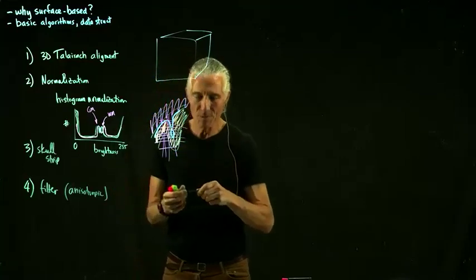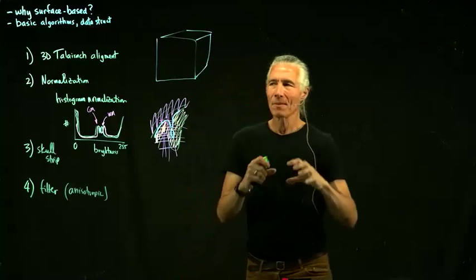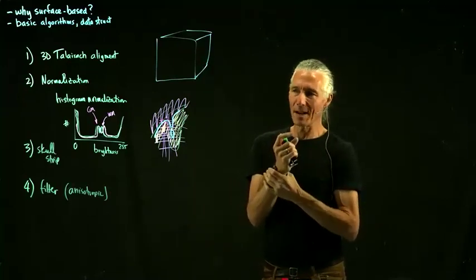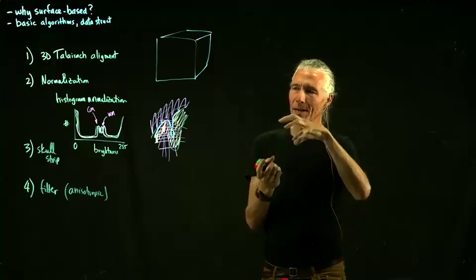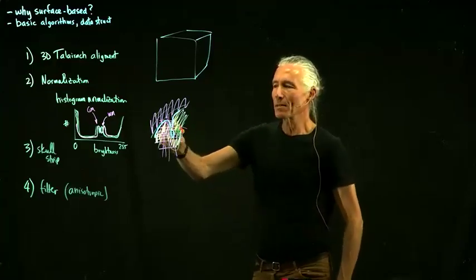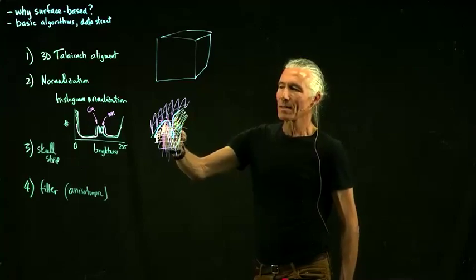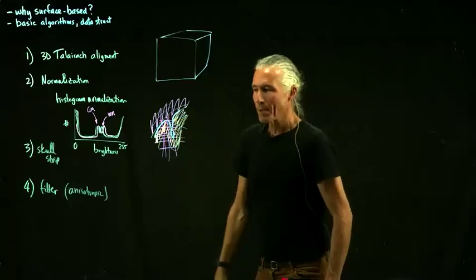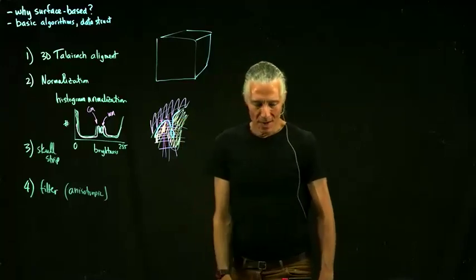How would you smooth it? You would do something like a 3D Gaussian. So convolve with a 3D Gaussian, blur the 3D data. That would fix this problem, because all the surrounding voxels in the sulcus are dark, so it would darken it down a little bit. But the problem with that is that it would blur the data set.